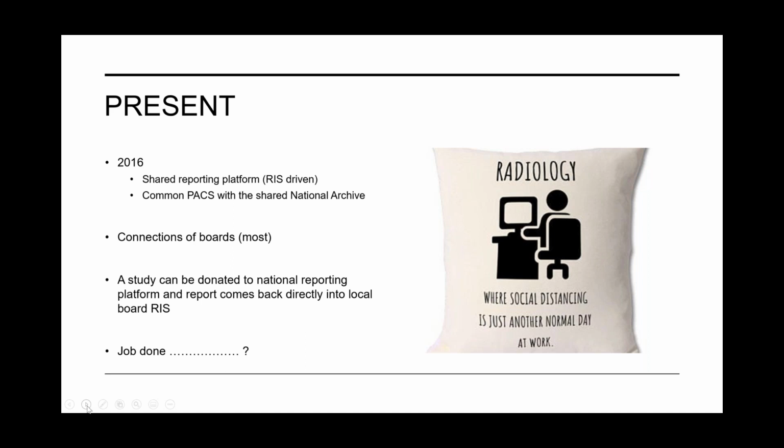But essentially where we are now is that we have the ability, certainly on site, to donate to the reporting platform, and a report comes back directly into the local board RIS. So if a radiologist in site B is reporting that, that report will go back into the donating board's RIS directly. That uses the PACS system. As I say, it's mainly for on-site. We have, obviously with COVID, been looking at the off-site capability, but that in itself has led to some challenges, which again, I'll talk about later.